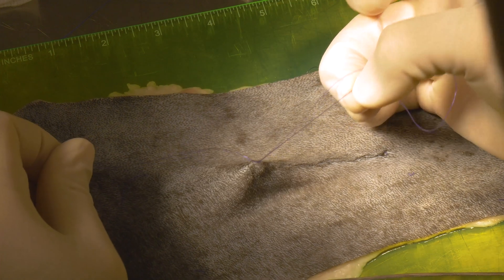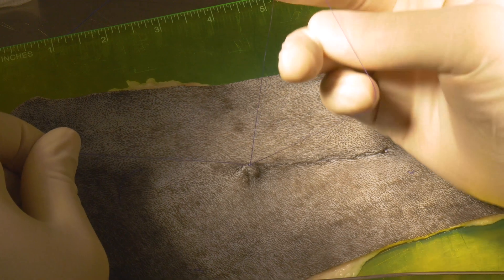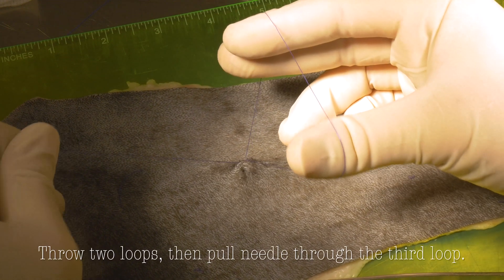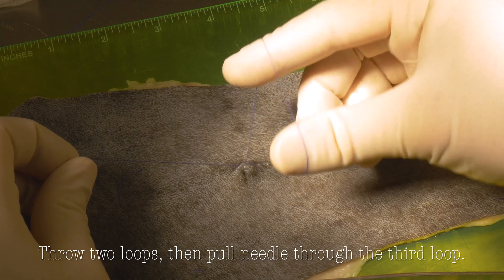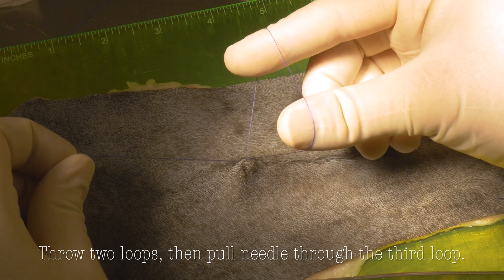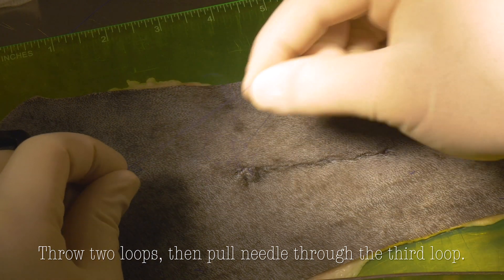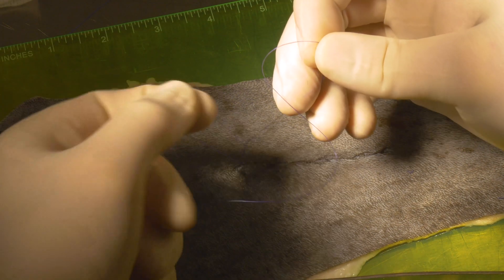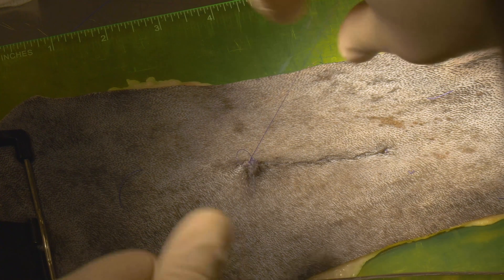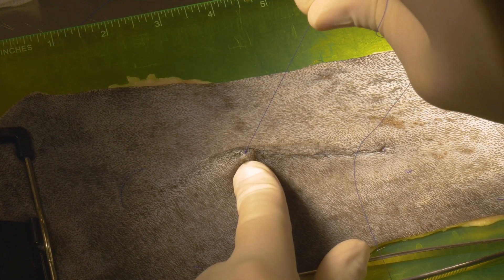This one you can pull up a little more, and you'll feel a little pop — you can probably even see it in the video. And now you could do that for days, making this daisy chain, until you make a really nice friendship bracelet. But for our intradermal suture pattern today, we just need to do it twice. Then on the third one, grab it, let go with your non-dominant hand, and pull the needle all the way through your loop. Then pull straight up — and that locks your knot into place. You'll notice it's a much smaller knot than your square knot.